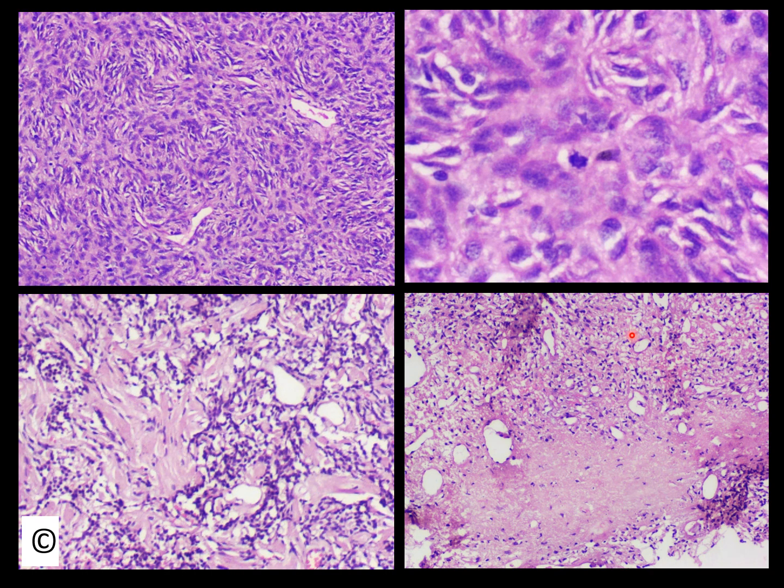So the cells in the solitary fibrous tumor are monomorphic. This is typical of tumors which show translocation. For example, solitary fibrous tumors, synovial sarcomas, and mesenchymal chondrosarcomas show translocations. The cells are ovoid to spindle with monomorphic round to oval or elongated nuclei. Pericellular collagen is present. SFTs may show ropey collagen or collagen in form of thick bands.